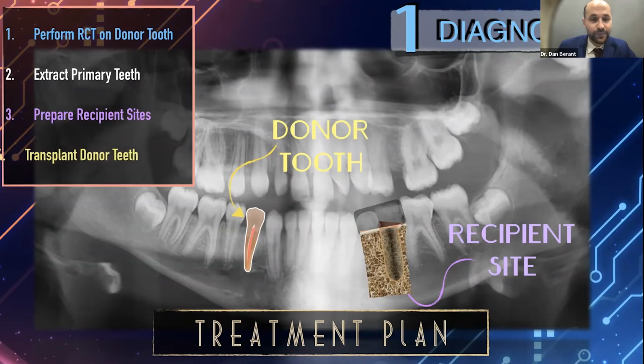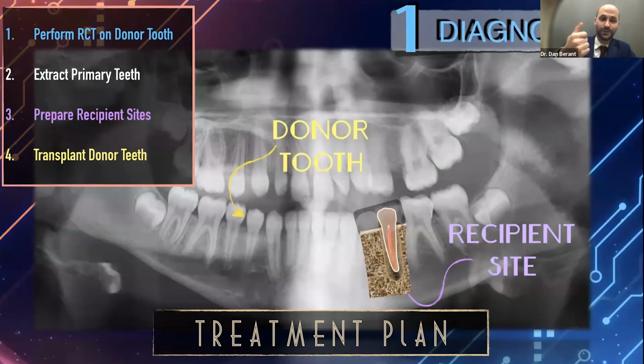And then finally, as atraumatically and minimally invasive as possible, we remove the donor tooth. In this case, although the animation goes back and forth, you're just purely rotating it and you place it into the recipient site. The key things for the clinician to keep in mind are that what increases the probability of success is minimal extraoral time and minimal damage to the donor tooth.